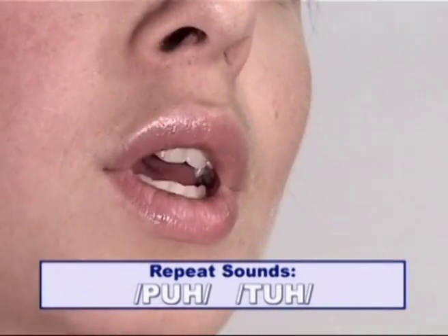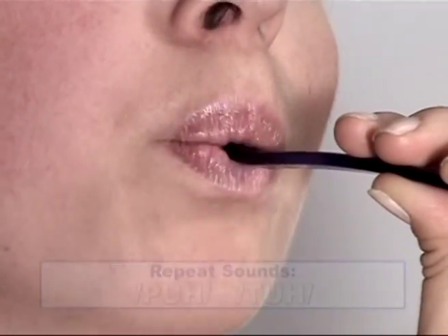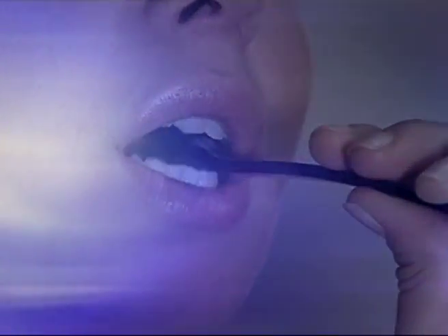Repeat sounds. Pa-ta, pa-ta. Record the number of pa-ta sounds articulated in 10 seconds.